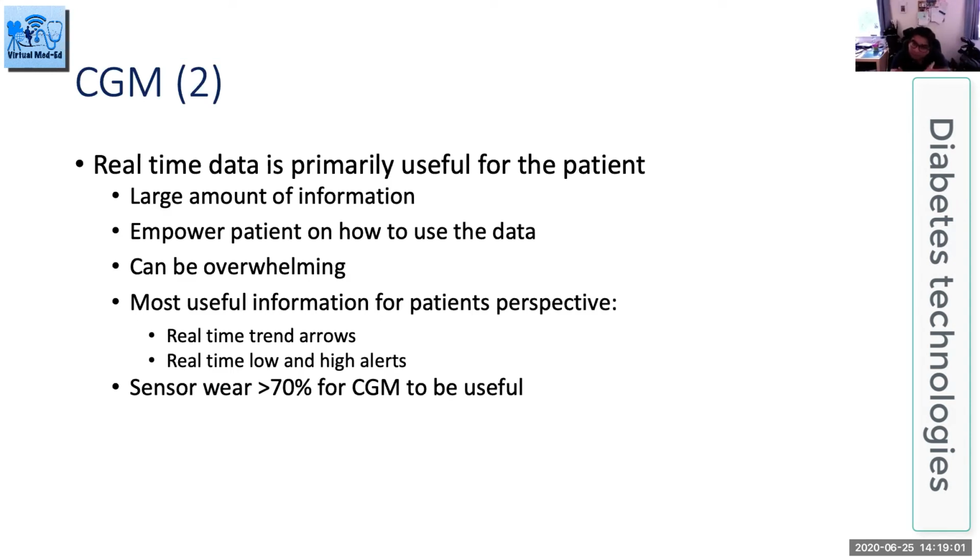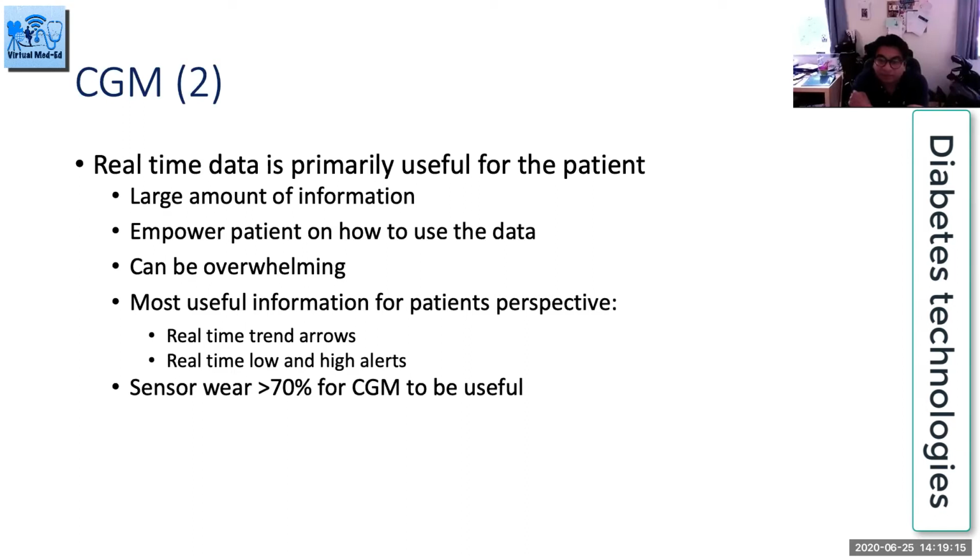I learned through my patients in the early days when I started CGM, I just used to give them the CGM without giving them much information about what to expect. I realized that was the wrong thing to do, and we need to be very good at this to be able to give them the right information. So it's worthwhile pre-planning, picking your patient, and sitting down with them and explaining what to expect. This is where we expect our diabetes specialists to be particularly good as well. But as consultants and registrars, we need to show leadership and understand exactly what it means.